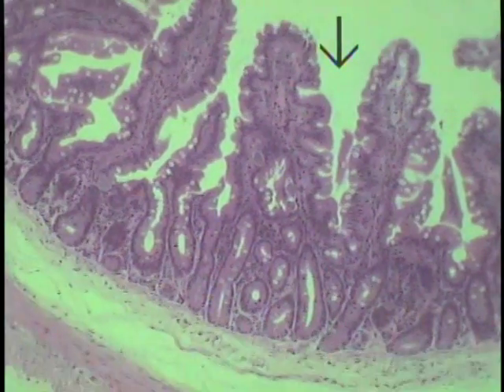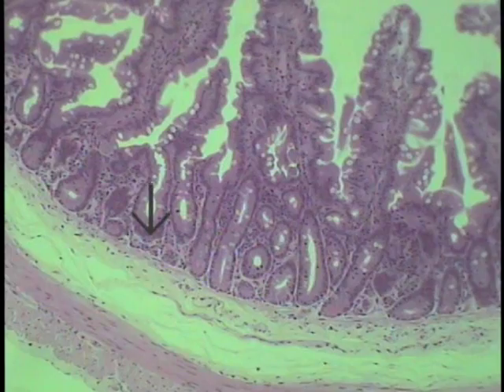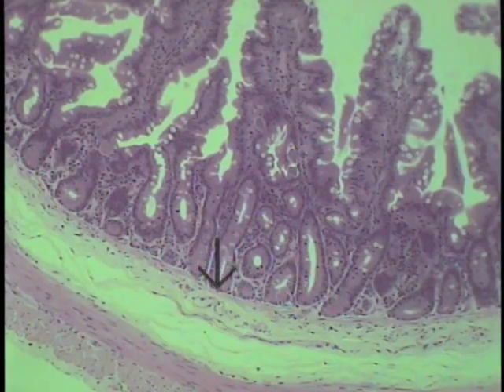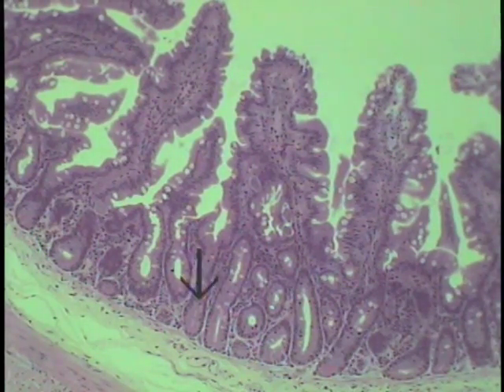But this segment of the intestine perhaps shows a little bit better, in particular this section, the intestinal glands or the crypts of Lieberkuhn, a little bit more lengthwise in their cuts. So each one of these represents one of those intestinal glands. The muscularis mucosae is showing right at the tip of the arrow and perhaps is a little bit thinner than more proximally. Once again, the lamina propria continues to form the core of the villi and surrounds the intestinal glands, as is shown here, so the rest of the features remain virtually the same.